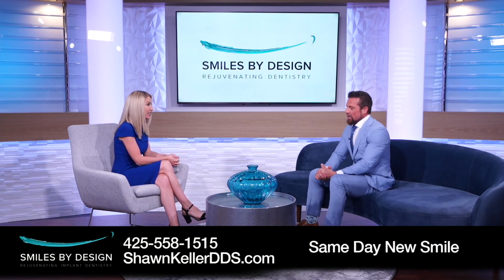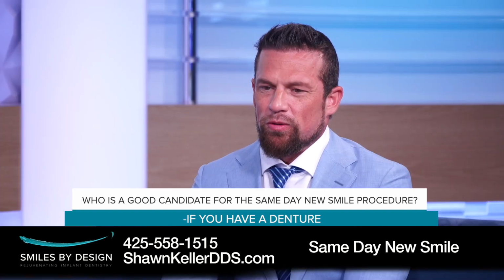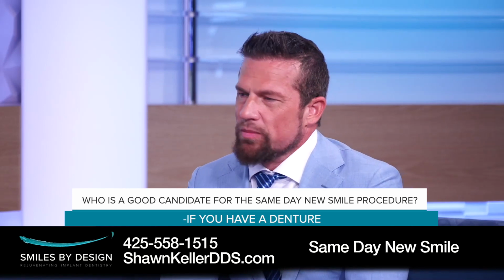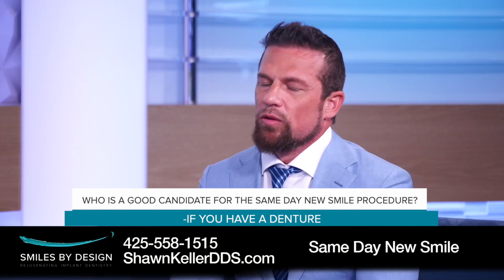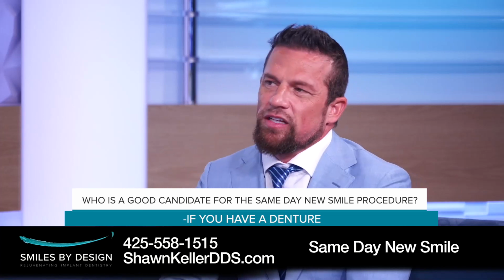Great question. The main people who are candidates for this are people who are already in a denture and they don't know that there's a better treatment out there. So if you've got a denture, you're slowly losing bone every year. And with this procedure, you can come in and one day we add the implants and we create the teeth instead of the denture, so you have a set of fixed teeth that day.